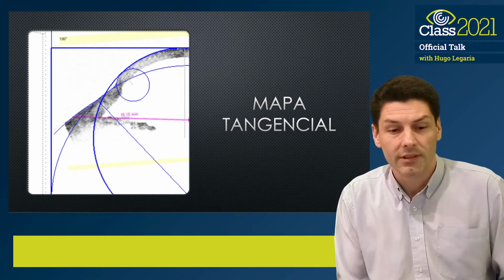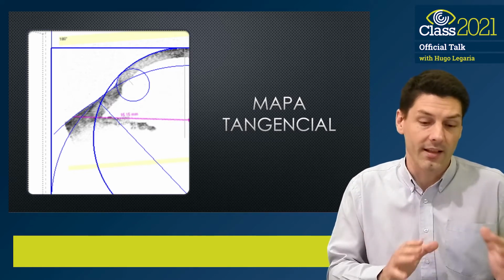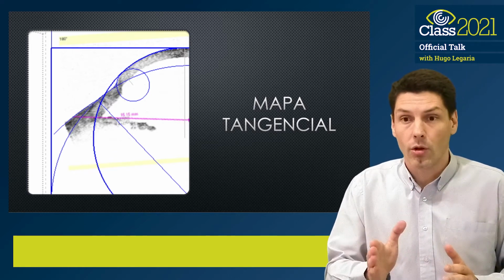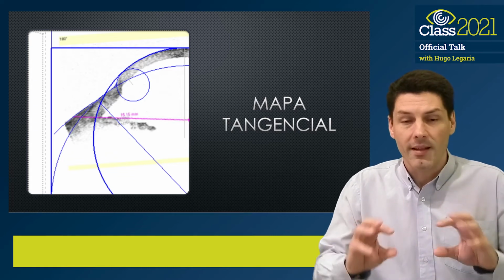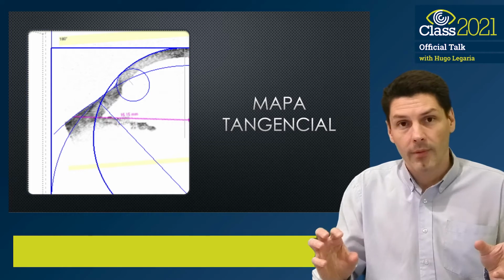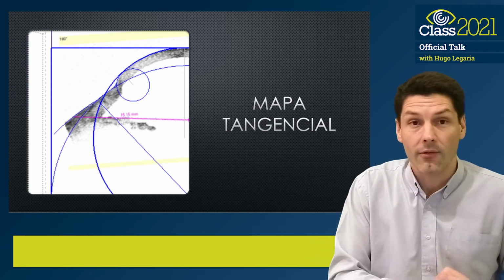And in this case, the surfaces that represent the cornea do not have to have their axis of rotation in the center, and it is not there. Therefore, there is a multiplicity of curvatures that will complete that shape and will give us more precision in the peripheral areas.